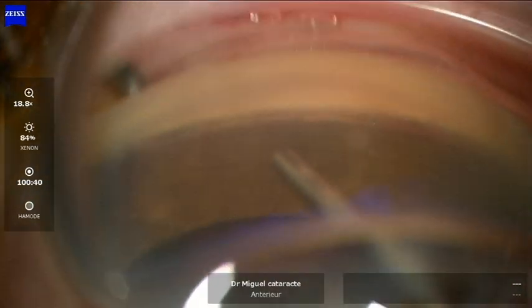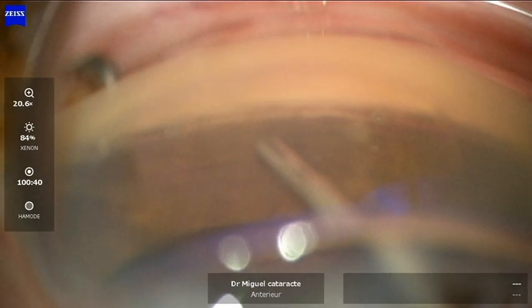Here I'm just trying to focus so that we can have maximal visualization with the camera.